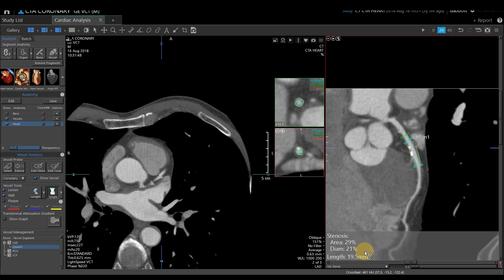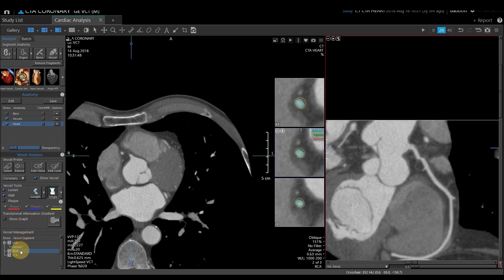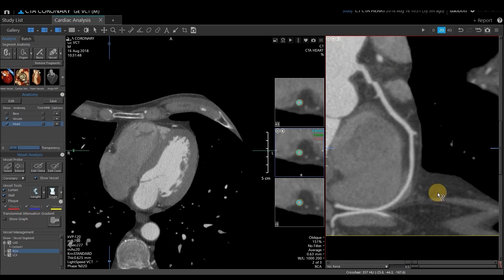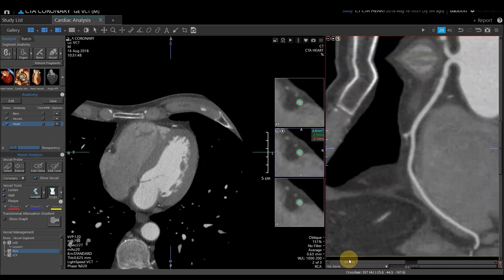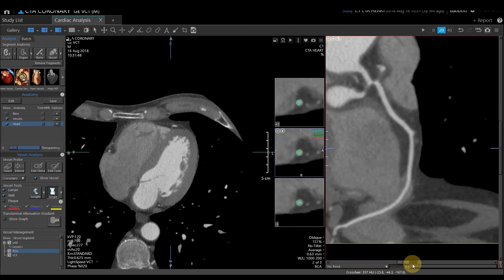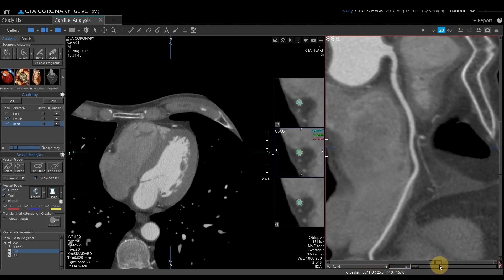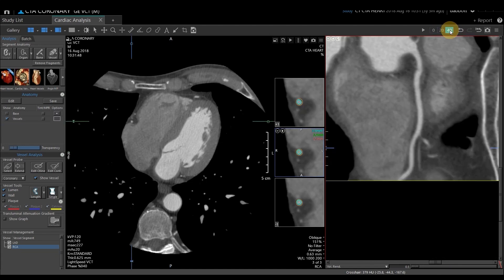If I'm done with the LAD and want to move on to a different vessel, I can come over to my Vessel Management section and select the RCA. I'll hit my little squiggly line and rotate that around. You might want to check the other phases to see if one is better than the other.